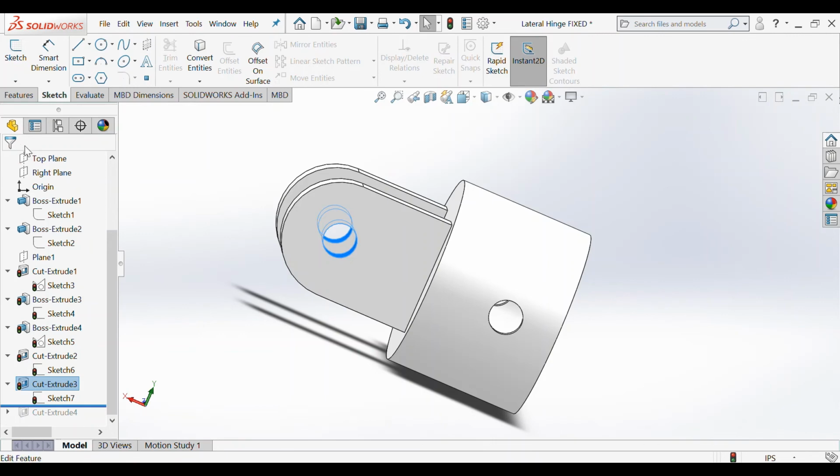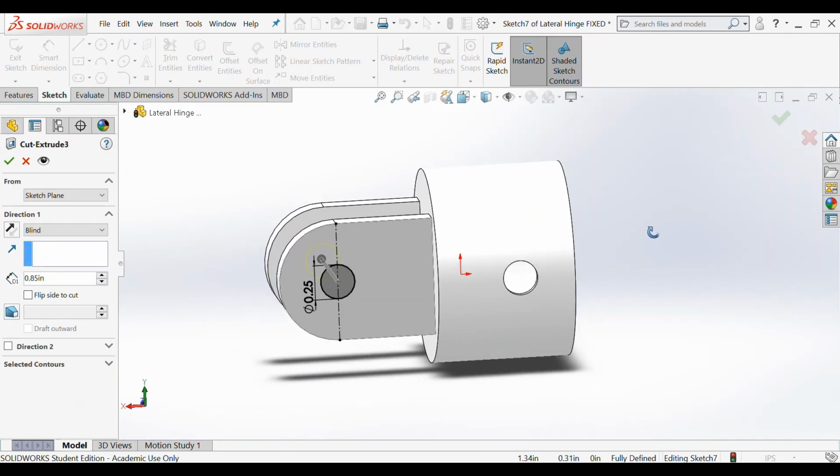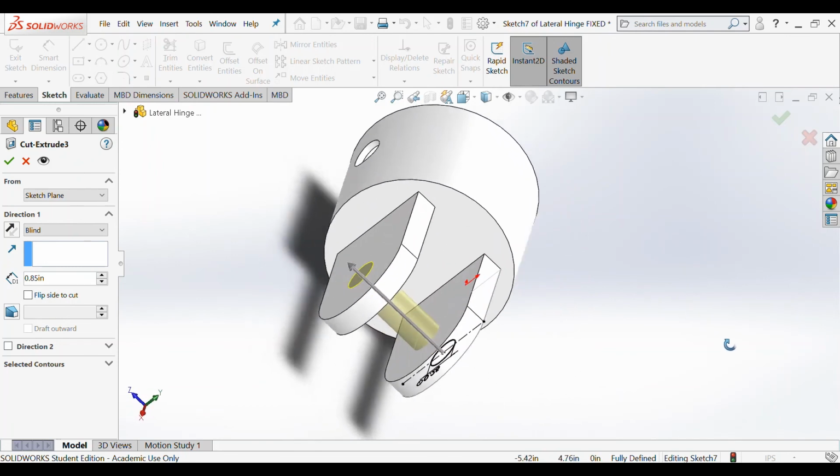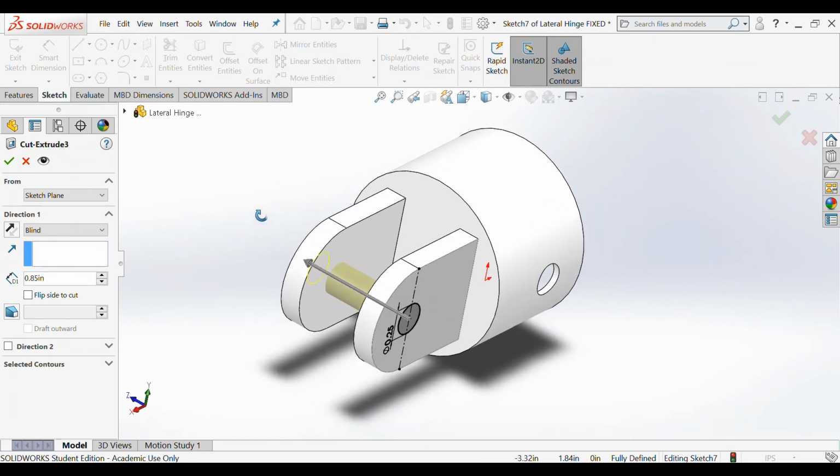Next, we're going to use cut extrude once again, and we're going to cut blindly 0.85 inches inward. This will create two holes all the way through both pieces. This will allow us to insert our axle piece, which will create a hinge for a lateral connector piece.